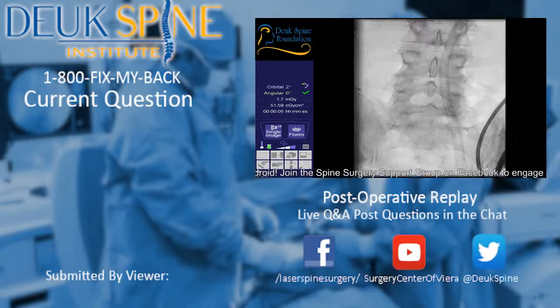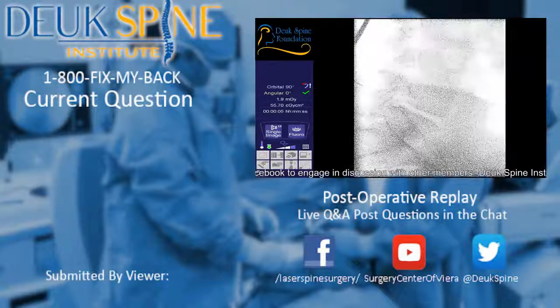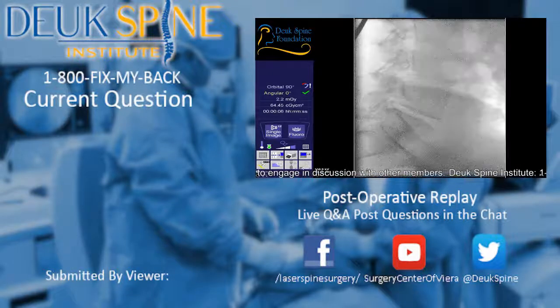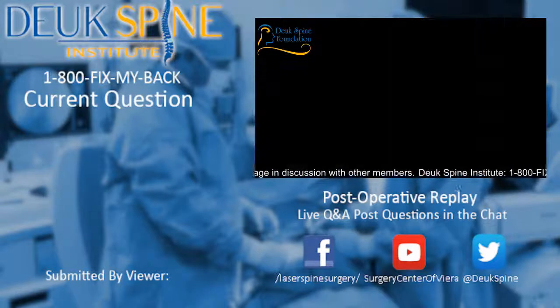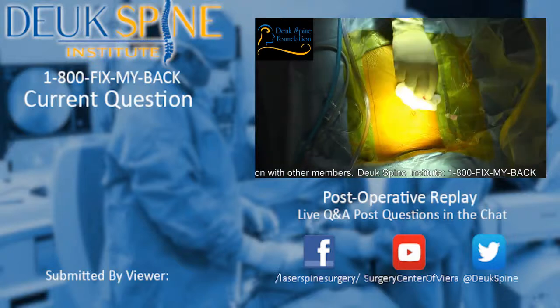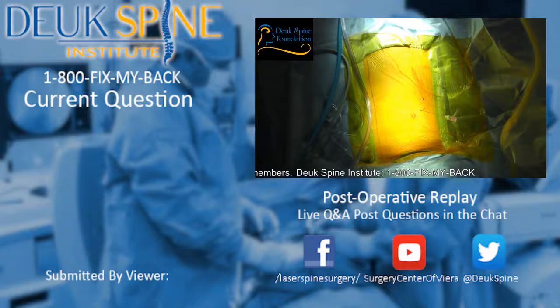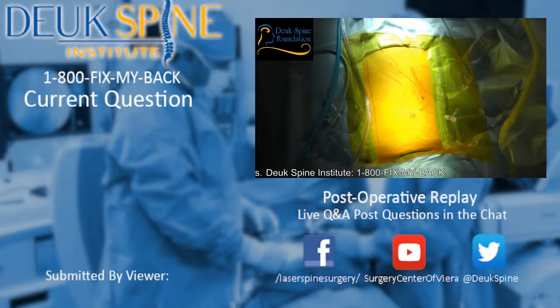The second patient had a prior fusion at L4-5 with screws and rods. So we had to work around the fusion and fix the disc above and below the fusion that were causing back pain from herniated discs. Finally, this last patient has had prior surgery with a microdiscectomy done in Colorado at L5-S1. He had a recurrent disc herniation at L5-S1, which was huge. He had a smaller herniation, but significant at L4-5. And both of them were causing back and leg pain on the left side.